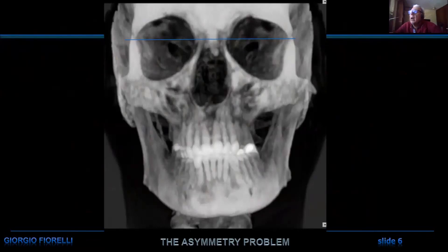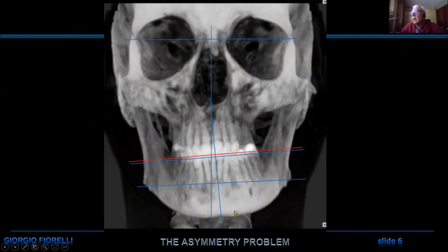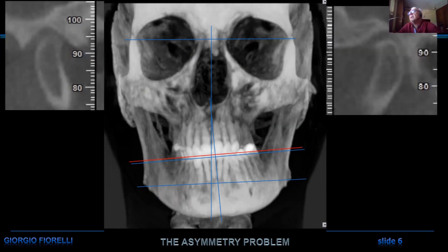We can go on with our analysis of skeletal asymmetry, and we can see things in the CBCT or in a posterior-anterior X-ray. We do the same thing, and we see more or less the same reference with the teeth, the same angulation, the same inclination. We also see an angulation of the gonial embrasure, but not as much as expected. In the CBCT, the really important thing you have to do is check the TMJ.